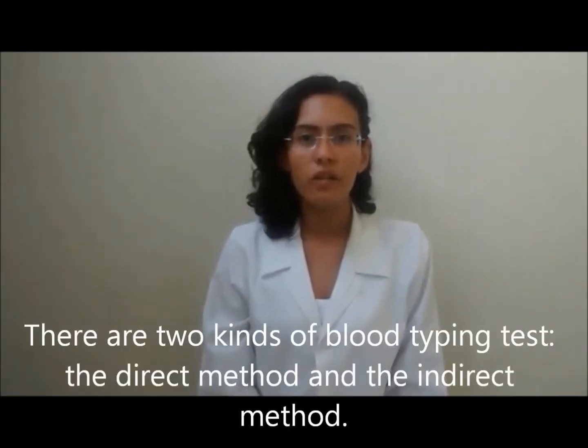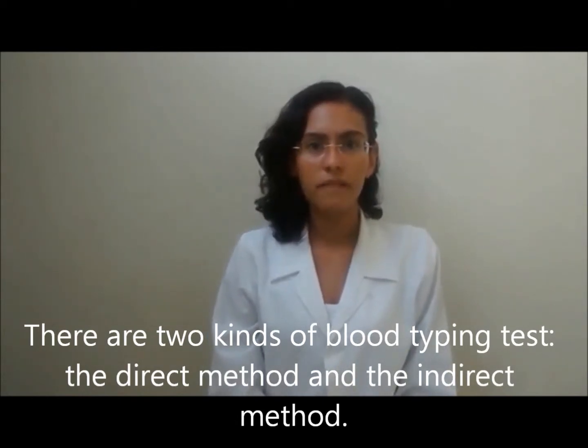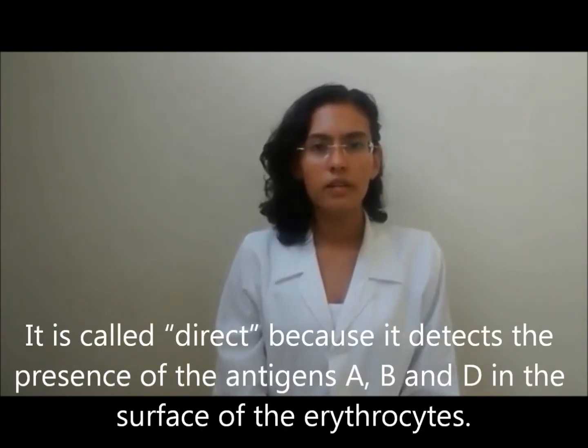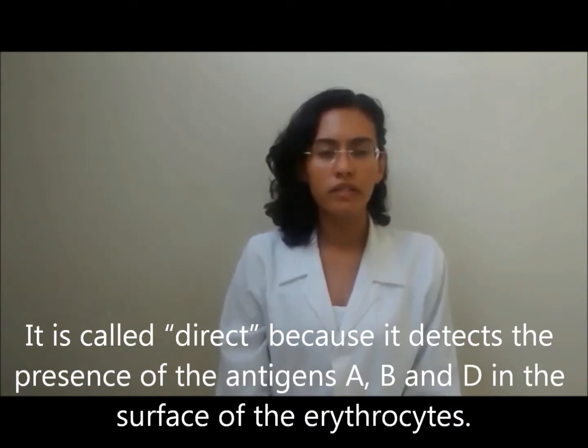There are two kinds of blood typing tests, the direct method and the indirect method. The direct method is the simplest one. It is called direct because it detects the presence of the antigens A, B, and D on the surface of the erythrocytes.